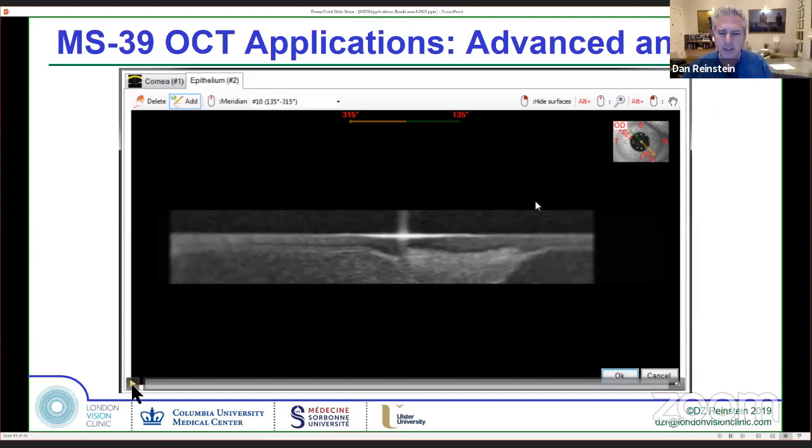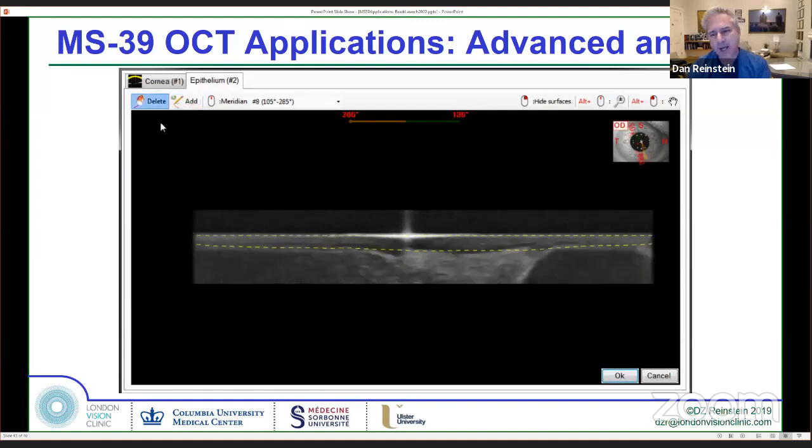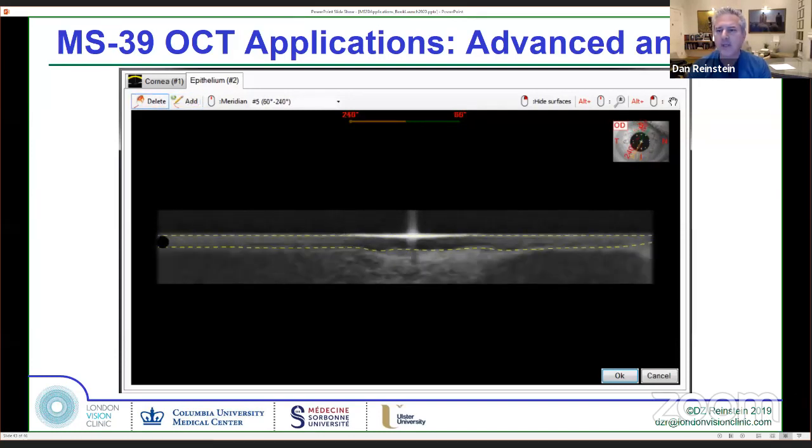And so I've just made a little video here. Ryan Vida, my research optometrist, made this video for you, showing how it's sped up a little bit. He's not this fast, but he's showing you how you can go through and erase and recreate these interfaces, going through every single angle back and forth in a complex cornea.